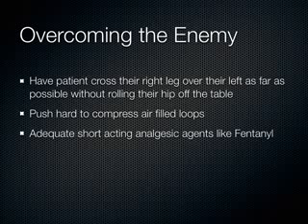We also are going to give the models fentanyl. We're going to give them narcotics today. Just kidding. No, but in reality, this is what you do, okay? People say ultrasound is a very operator-dependent thing. Some people are good at finding the appendix, some people aren't. No. Appendicitis is a very fentanyl-dependent thing.